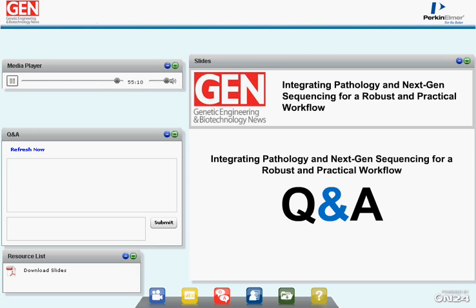Thank you. Bob, we're back to you. Although you did not comment on other library preparation methods such as exome sequencing, do you see similar relationships between DNA quality and overall assay performance? Yeah, so in our laboratory, we use a variety of different methods. Our clinical assay uses the amplicon-based capture approach, but we do have other test development and research projects where we're initially shearing the DNA, ligating on adapters, amplifying, and then doing the bead-based capture.